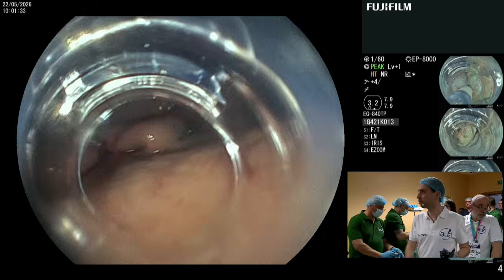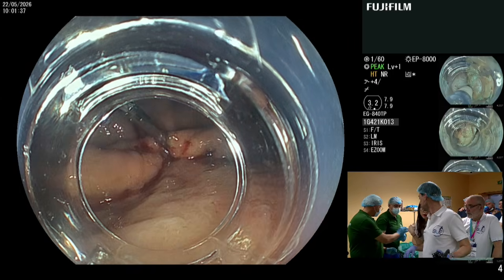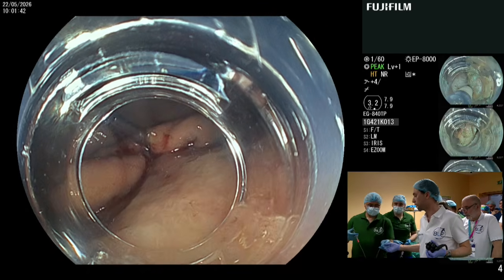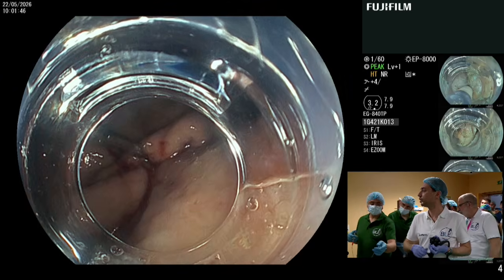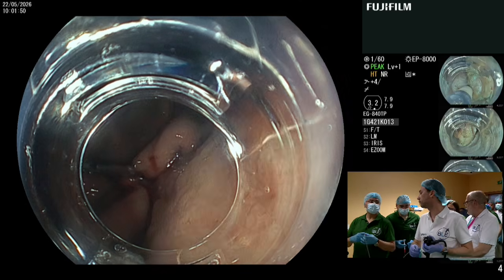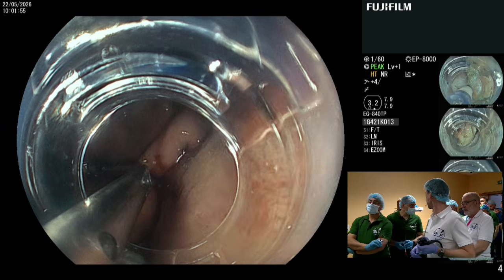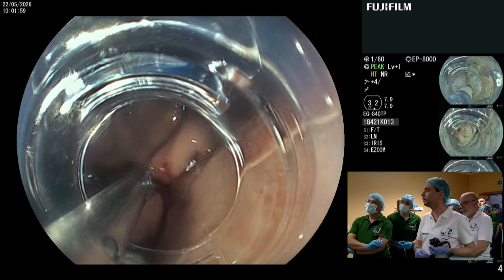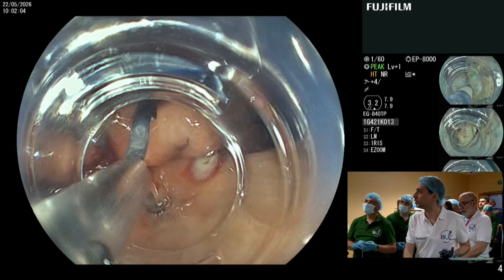The other way we can do it is to use the endoloop technique. If you want to try. Okay, we can try it again. I will use one more mantis clip. How much time do we have? We have 20 minutes? Because I can demonstrate the technique with endoloop, which is very interesting for everyone, I think. Open. As much time as you want, Georgios. Okay.